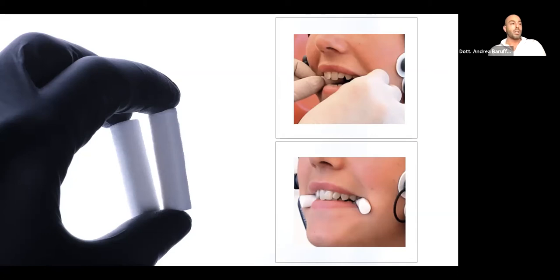With the calibration, we are sure that the result will describe accurately what is happening in that precise moment. So we need to calibrate not for every analysis that we perform, but for every session. So day by day, we need a new calibration.